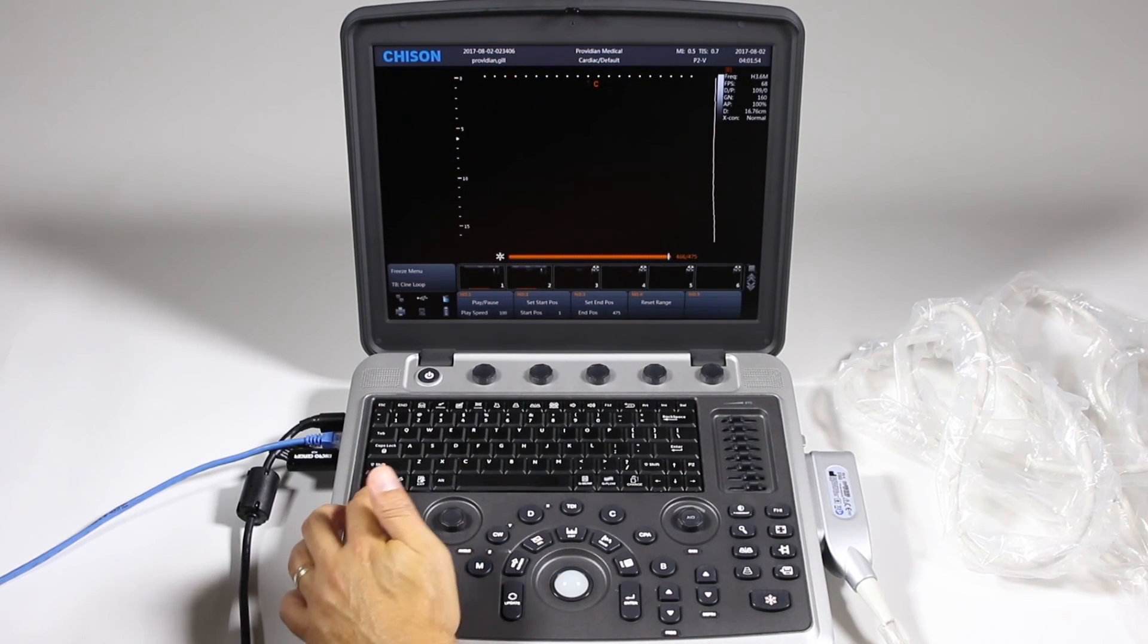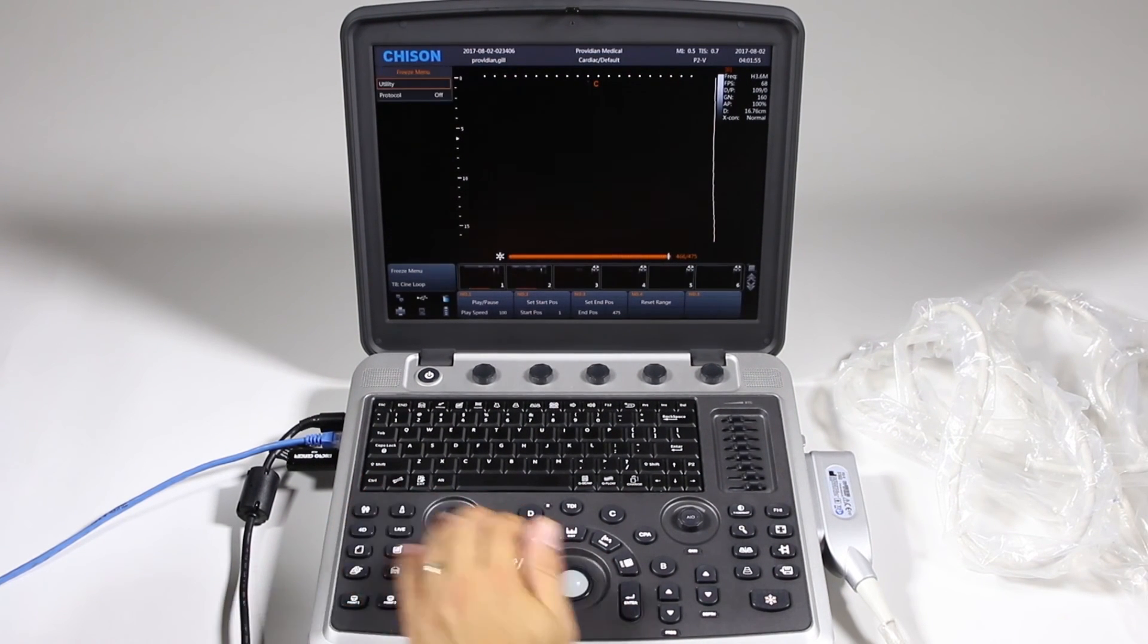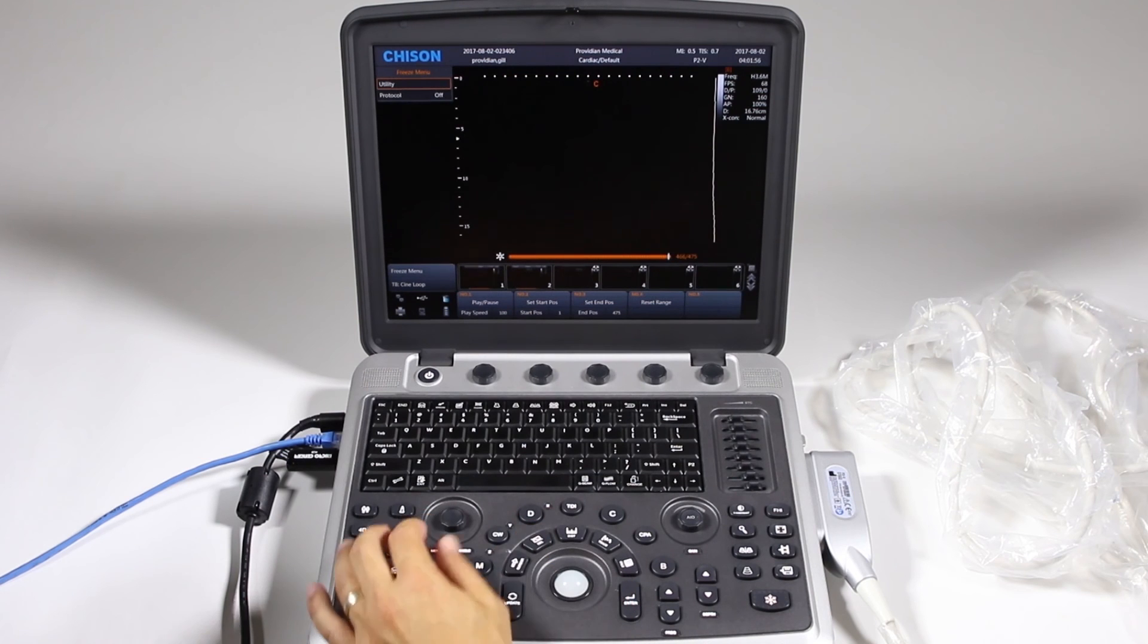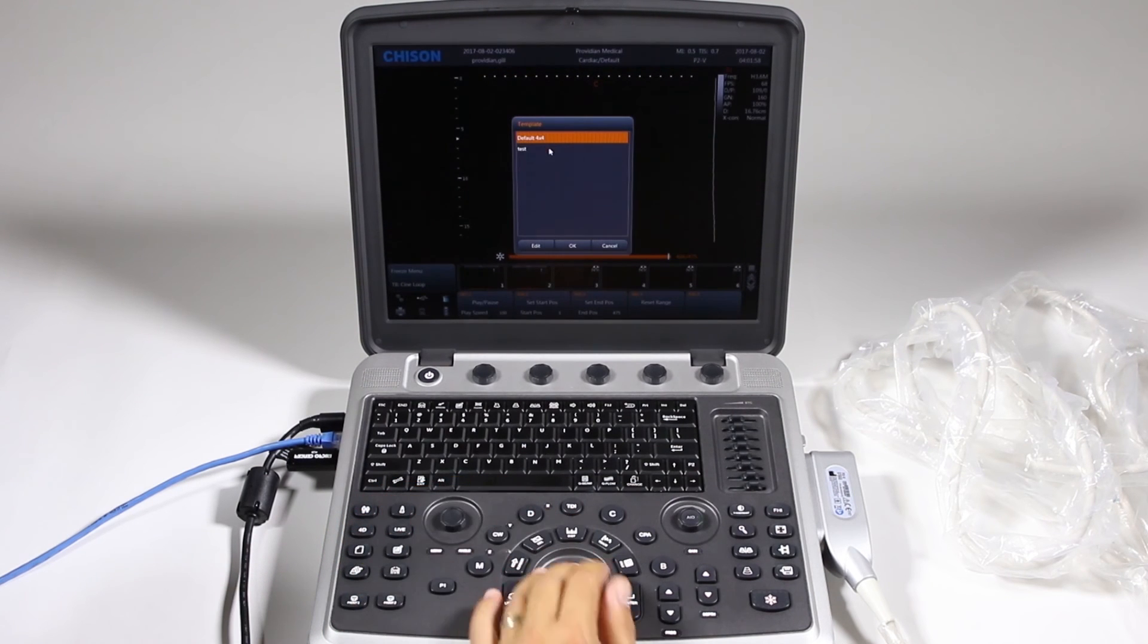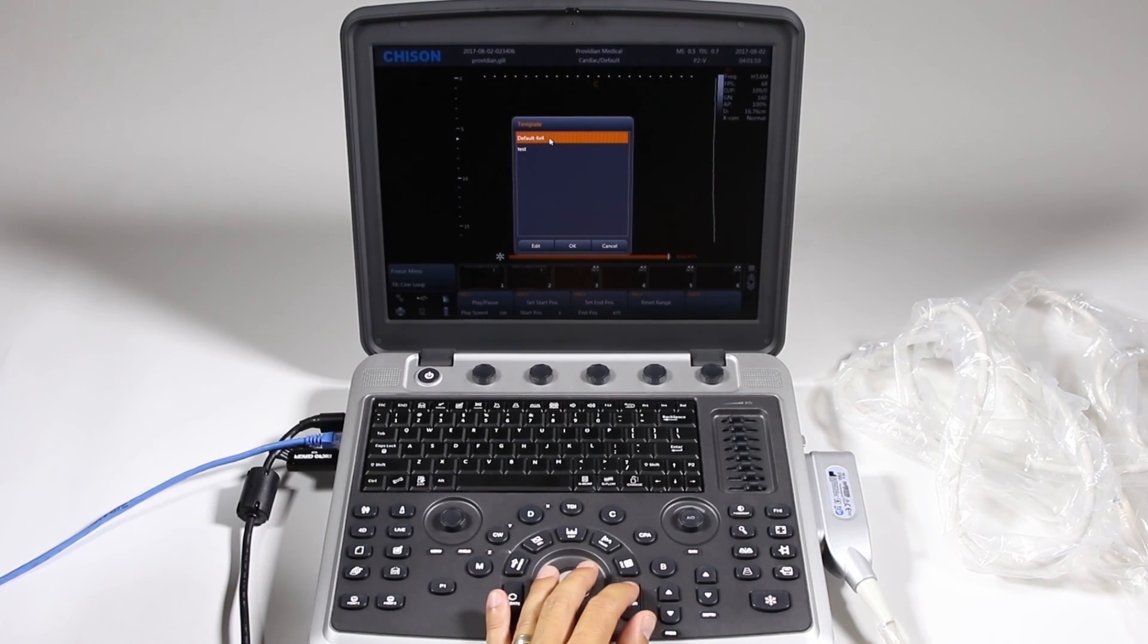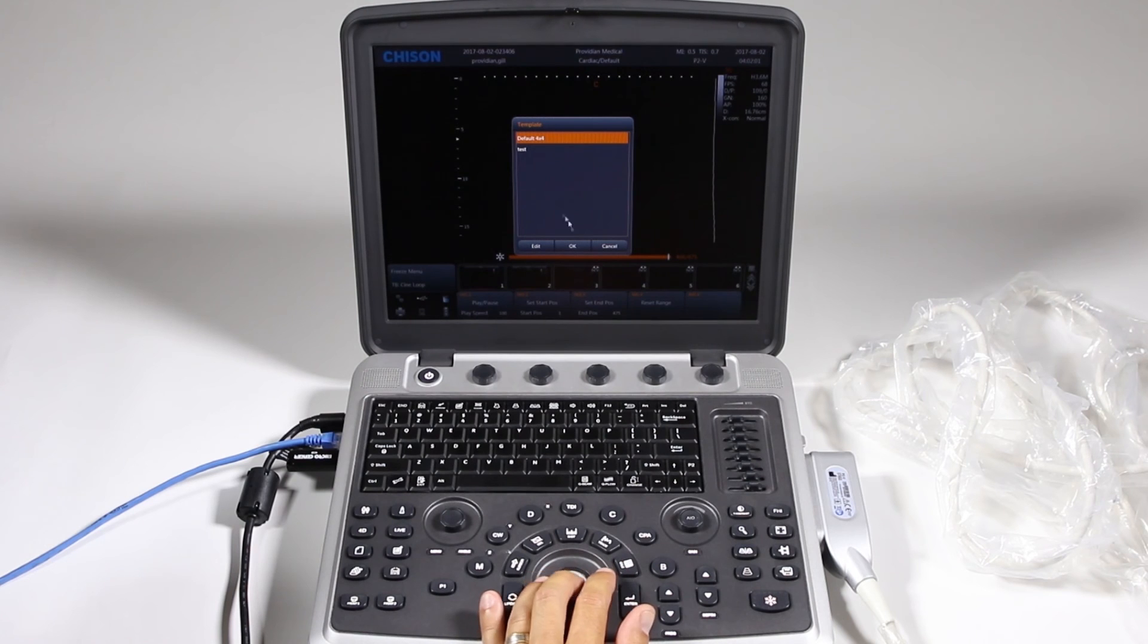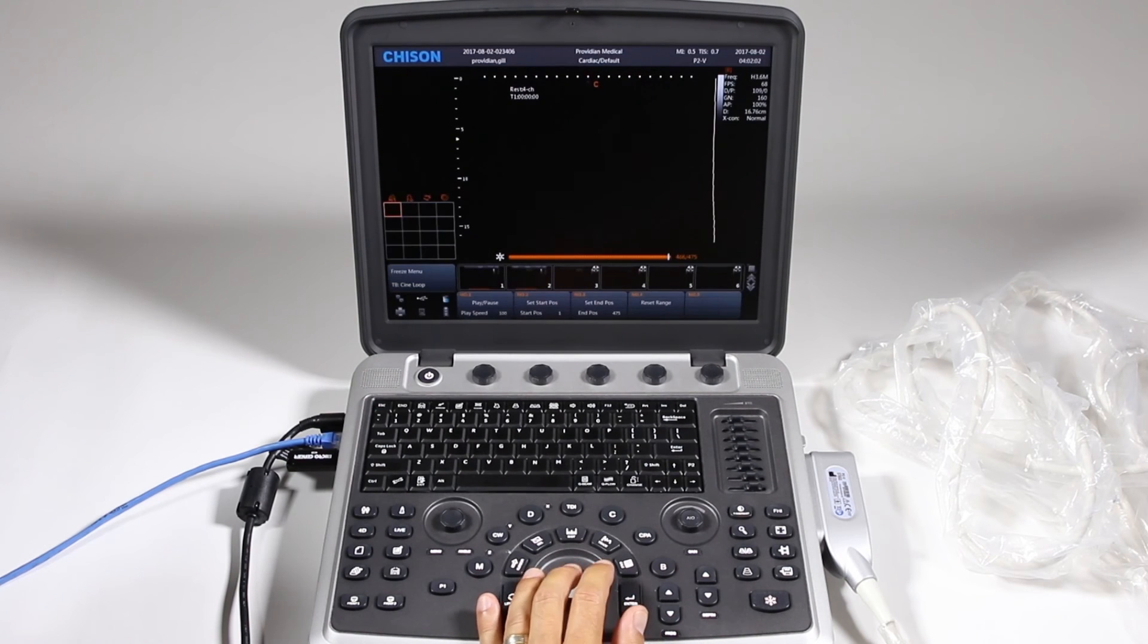I want to go back into, click that, go to protocol, click it on and I want this default 4x4 which comes in the system. Click OK.